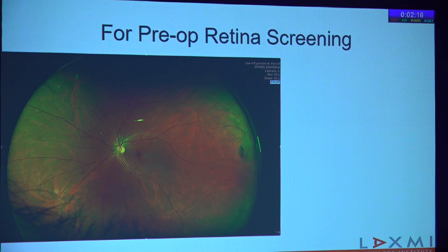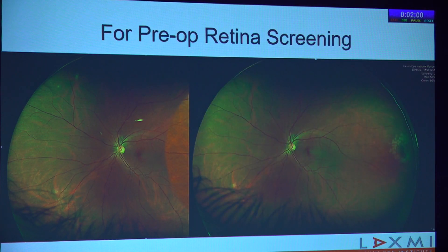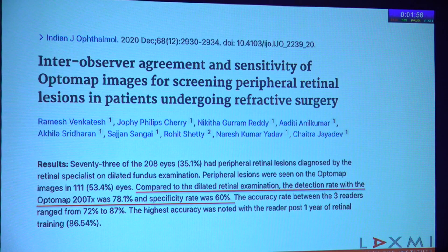One described use of this modality is for pre-operative retina screening. This is a patient who came for pre-LASIK screening, and you can see a pigmented lesion in the periphery — probably just some pigment, but there is a small atrophic hole associated with it. We performed a laser barrage, and this is nicely documented. A nice study done from Narayana Nethralaya looked at inter-observer agreement and sensitivity of Optos for screening peripheral lesions in pre-LASIK patients, finding a detection rate of 78%, which as a screening modality is excellent. So if you find even one lesion, you barrage it before LASIK; if the test is negative, you may then consider dilating the patient and looking at the fundus in more detail.